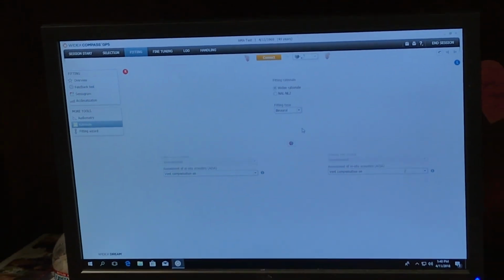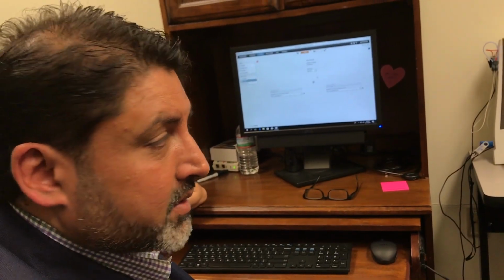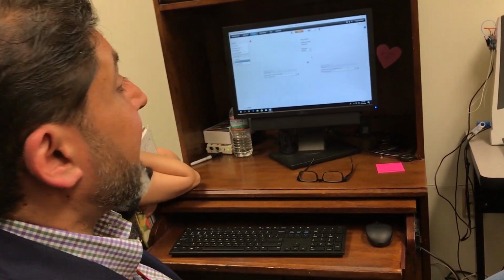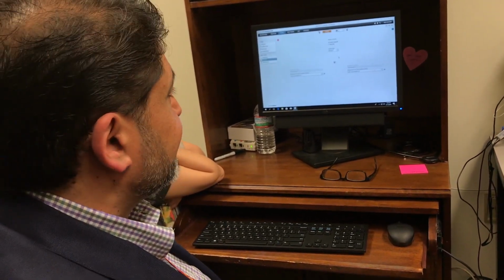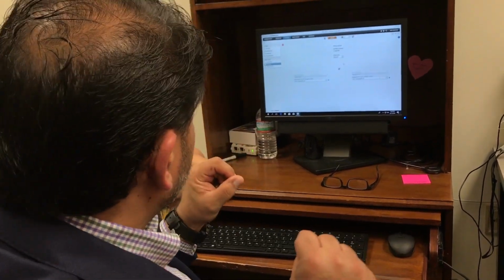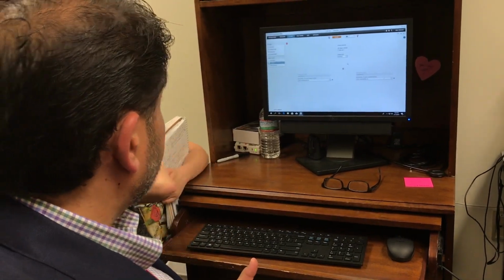The problem with this in every single manufacturer is it's not true NAL-NL2. It's their version of it. They reduce the gain by approximately how much, if you listen to Gus? 10 or something like that, dB. If you don't do real ear, are you providing the right amount of gain?